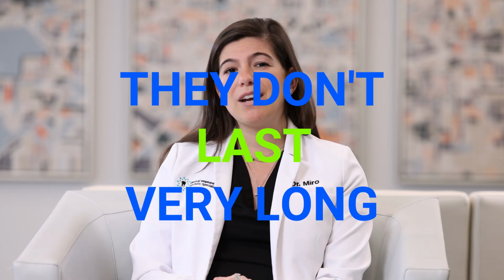A big problem with them is they don't last very long. Usually when you get one of these, they last max two months, three months. They're not something that's made to have longevity. They're very soft and they tend to break down quite easily. Another thing is they trap a lot of bacteria just because of the material they're made out of, so it takes a lot more to keep them clean and keep that mouth nice and healthy.